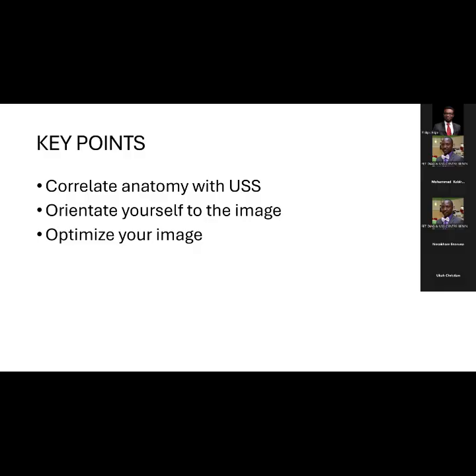So if you place your probe anteriorly, it tells you where the cervix is, and from there you're able to get your orientation of how the uterus is. And subsequent examination will then determine so. So that's why your probe hits the anterior wall before the posterior wall. If the uterus is retroverted, the reverse will be the case. Your probe is going to hit the posterior wall before it gets to the anterior wall.